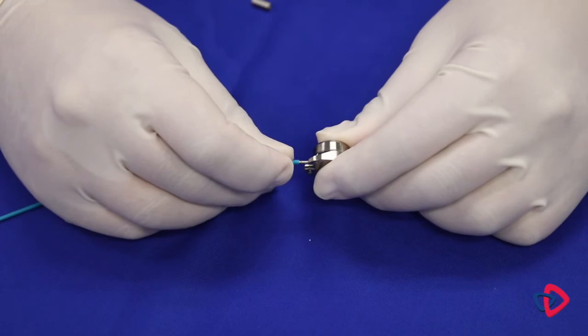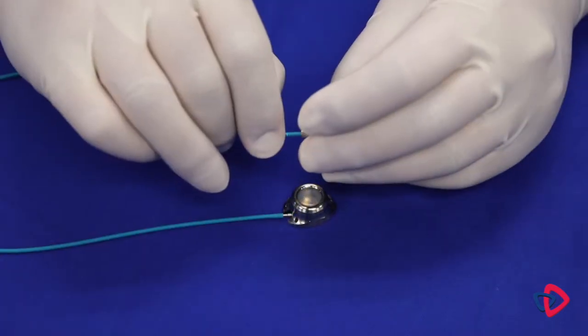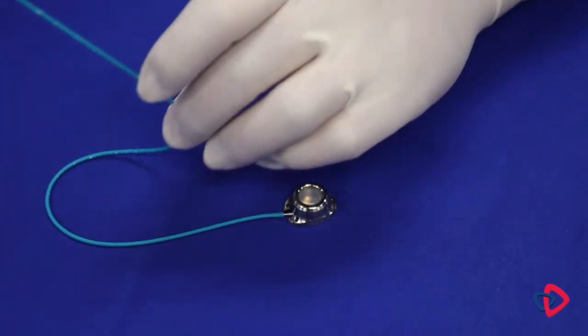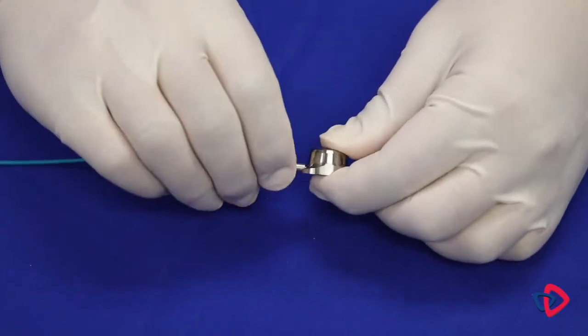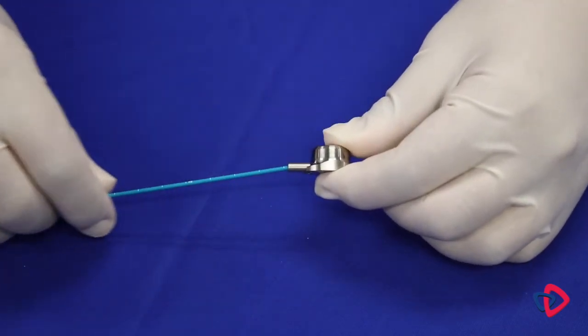Advance the catheter over the port stem to the midway point, slightly past the first barb. Slide the snap lock connector toward the proximal end of the catheter. The locking mechanism is bi-directional and can be oriented in either direction. Advance the snap lock connector, pushing from the back of the lock, until it engages with tactile and/or audible feedback.